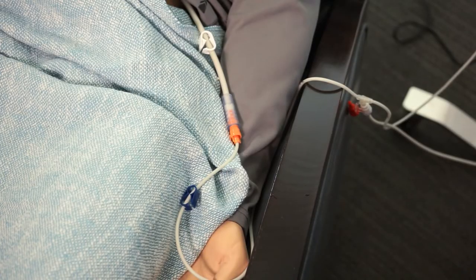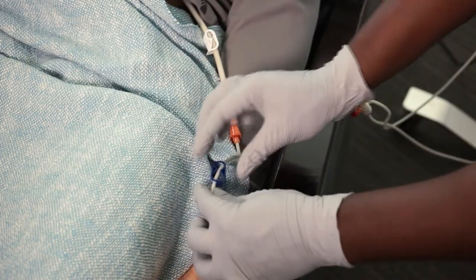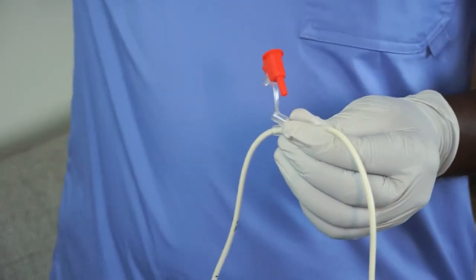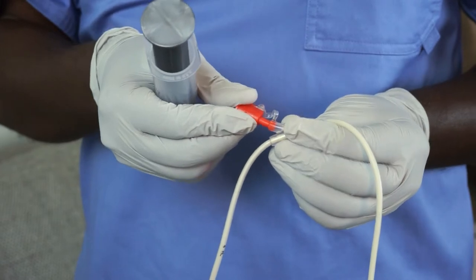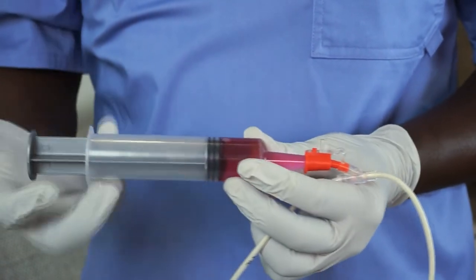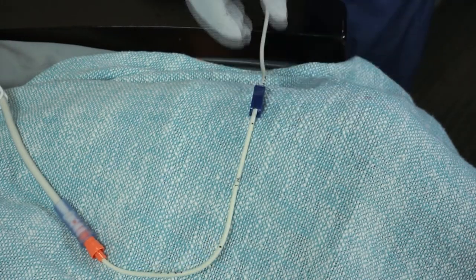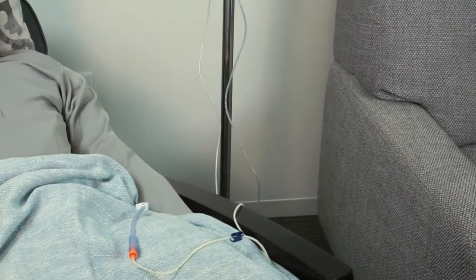If no feeding tube access port is available, pause feeding and close both the white and blue clamps on your Feral valve. Detach the feeding set from the Feral valve Y-port and connect the provided medication port adapter. Open the blue clamp on your Feral valve to administer medication.